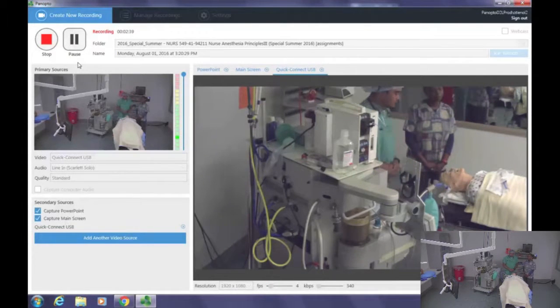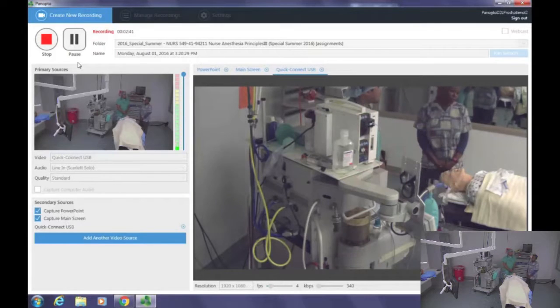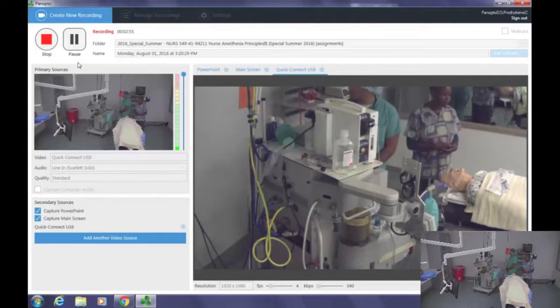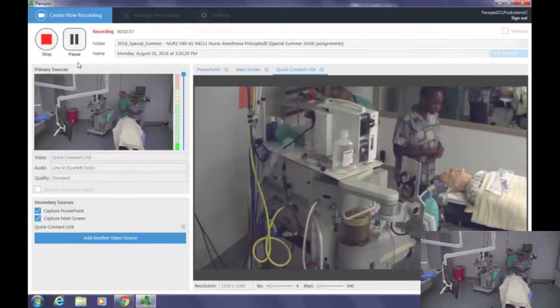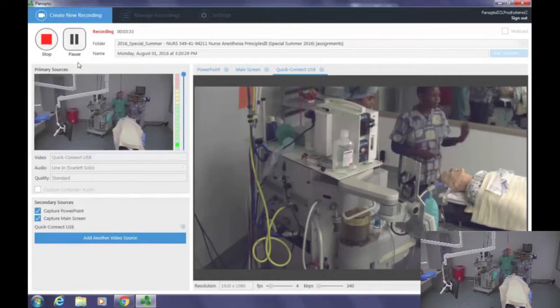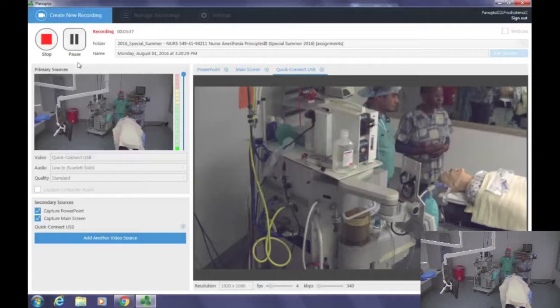The other thing is that I just wanted to let you know the patient was pre-medicated in the holding room. He was given 2 milligrams of Versed IV. He's a young guy. He seemed a little bit nervous, so that was indicated. Also, patients who have vascular pulmonary issues, we need to take all that into consideration.